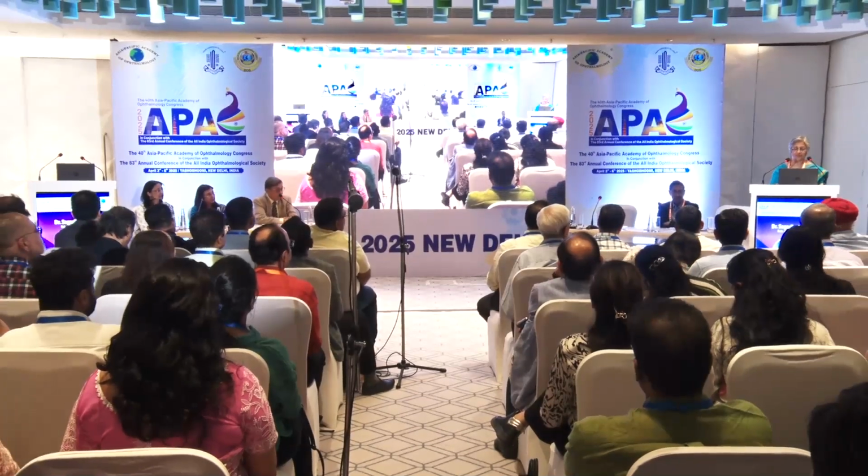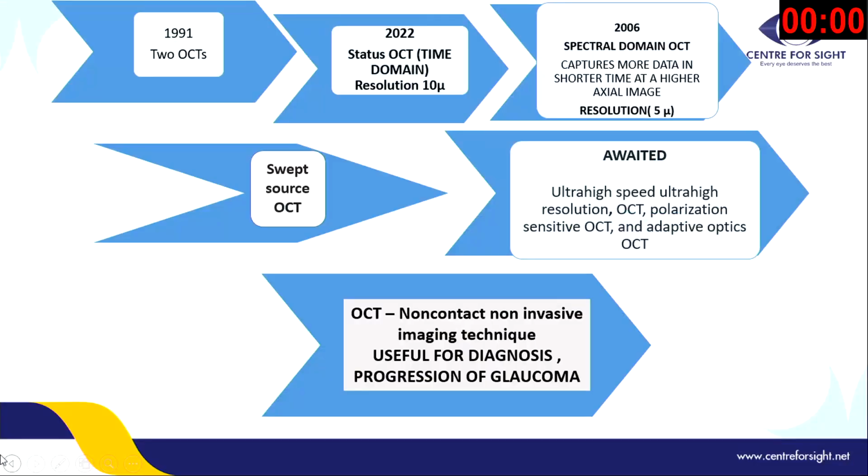And I'll go straight into what is the role of OCT in glaucoma. We all know that glaucoma has come a long way. So, just think about it, 1991.